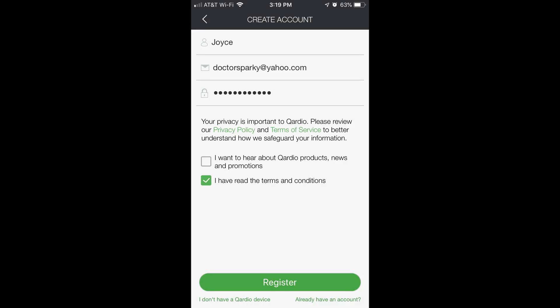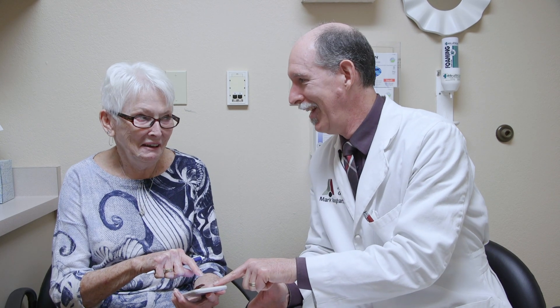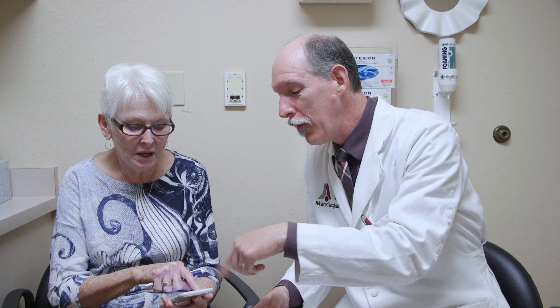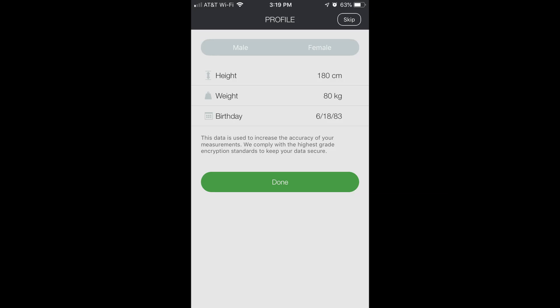I recommend marking that you have read the terms and conditions — only if you actually read them. I have read that, but not the other one that says 'send us lots of junk mail.' Just checking the terms and conditions allows you to register. It then asks for weight, height, and birth date.